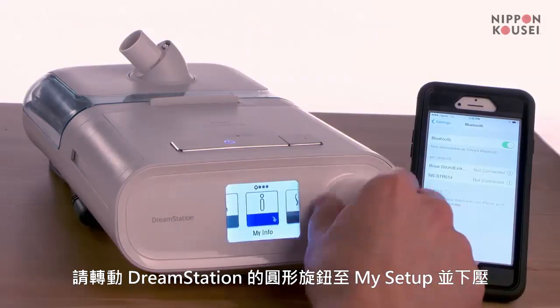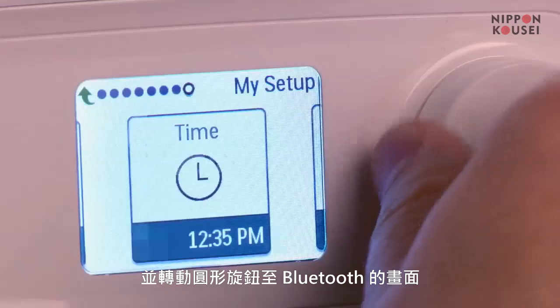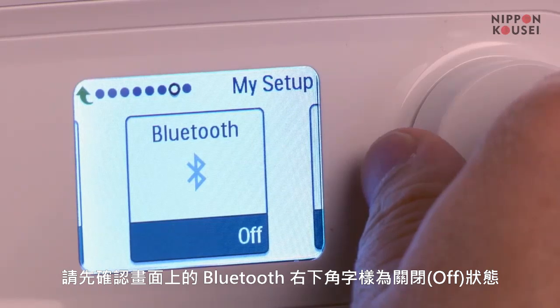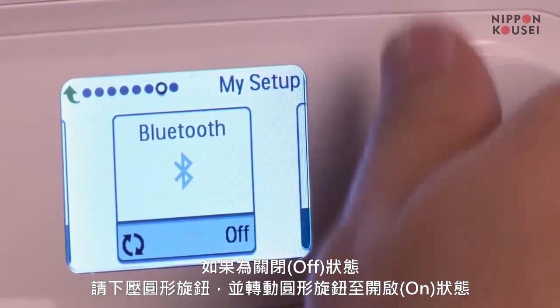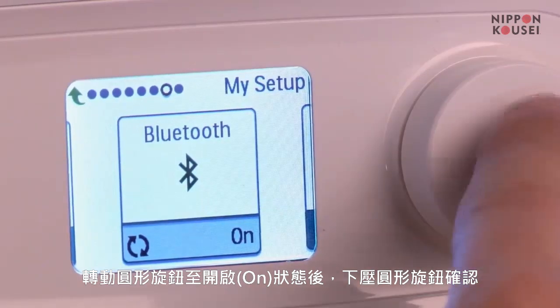On your DreamStation, select My Setup and turn the dial to Bluetooth. Once you get to Bluetooth, verify that it says on in the lower right-hand corner. If it is off, press and turn the control knob to on. Once Bluetooth is on, press the control knob again.